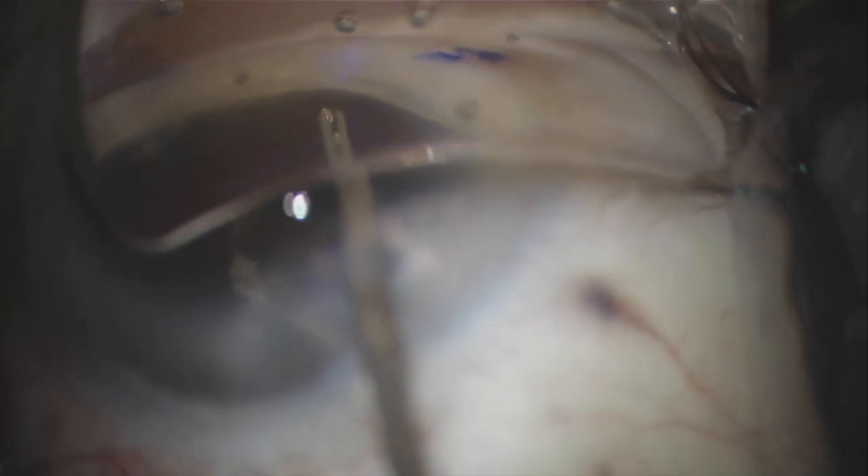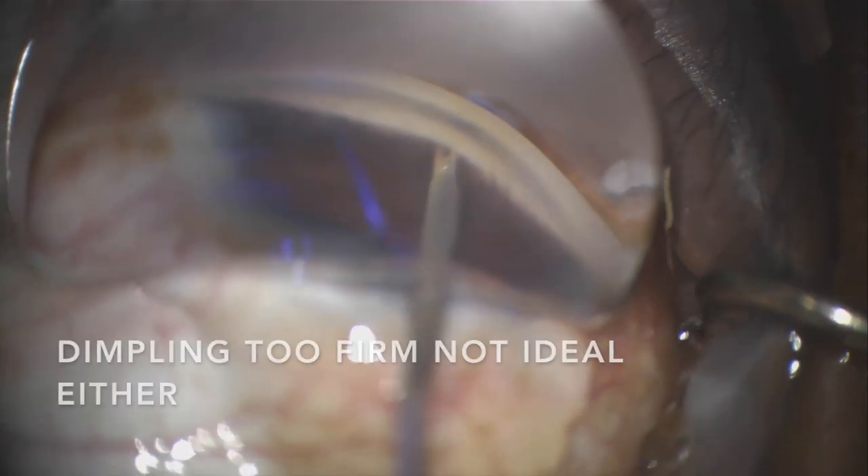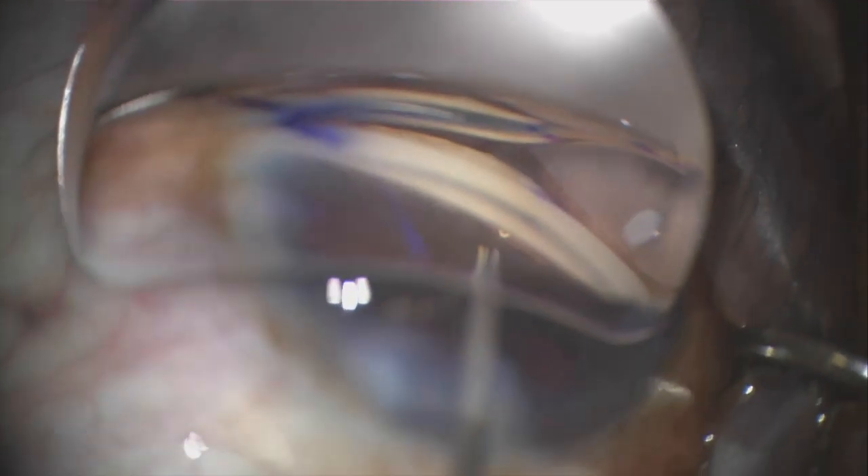Trying to reload the half-millimeter stent can get tricky and sometimes time consuming. Also note that if the dimpling is overly firm, the stent can actually get embedded deep into the TM, and we don't want that either.